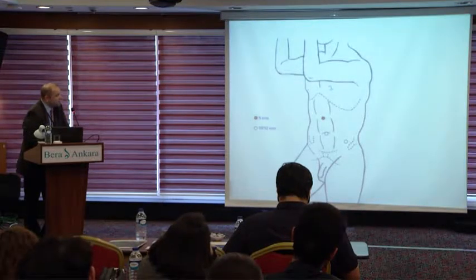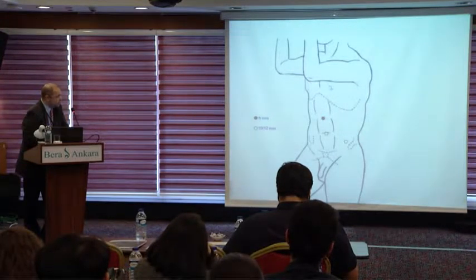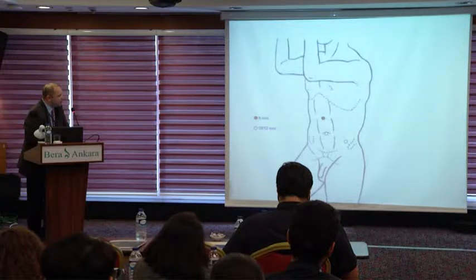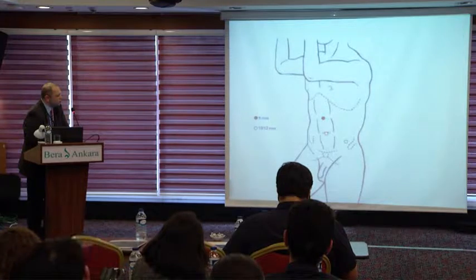That's the traditional places of the ports. That's the camera port placement just on the umbilicus. That's the 5 mm left-hand working port place. And that's the 10 mm right-hand working port place. But in our clinic, we usually place the ports 1 or 2 centimeters above or lateral to these dots. You will make a triangle to work on.